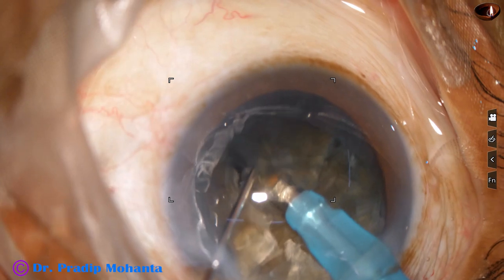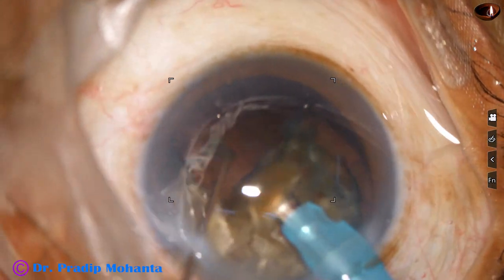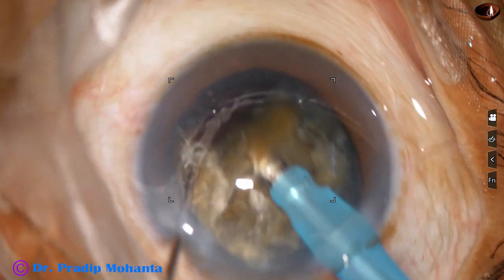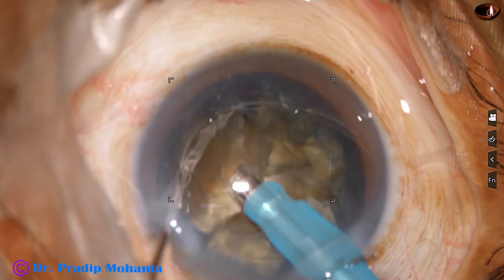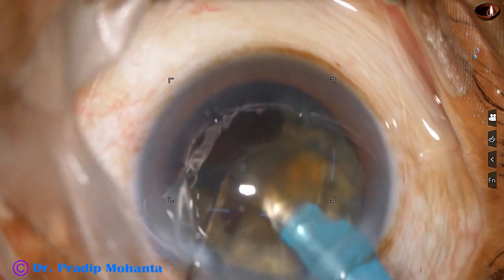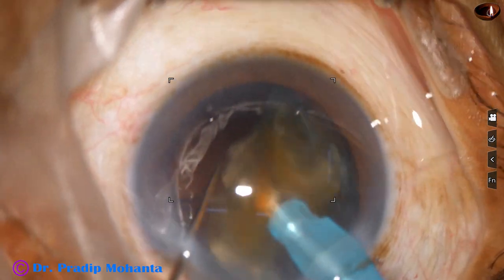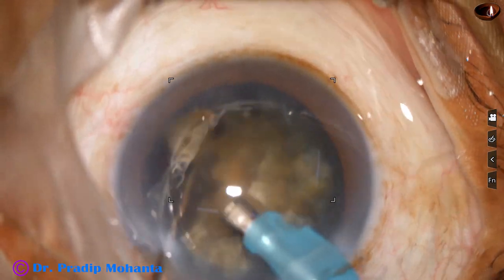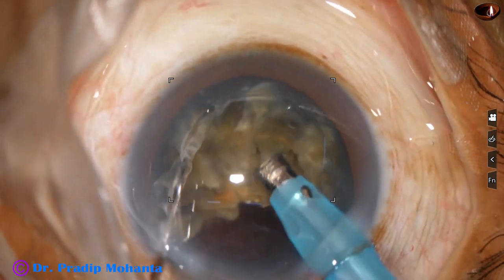This is the other heminucleus. This fragment is free and I'm emulsifying it. And this is the larger piece of the heminucleus. It is subdivided into two pieces and the pieces are removed. Now let me tell you the settings.